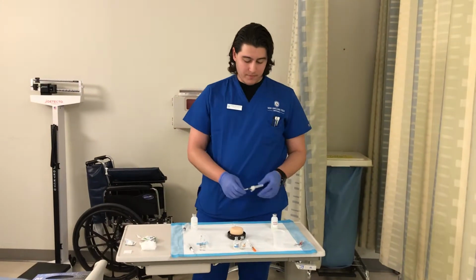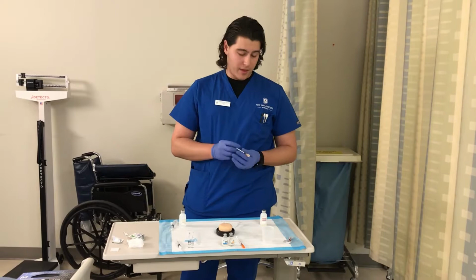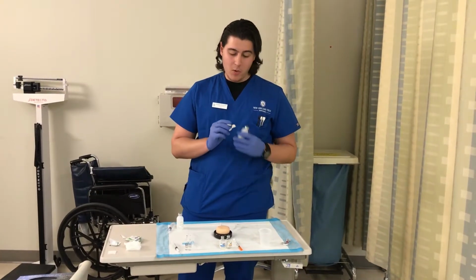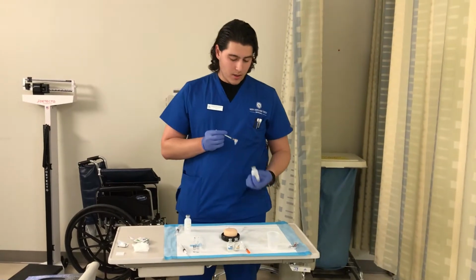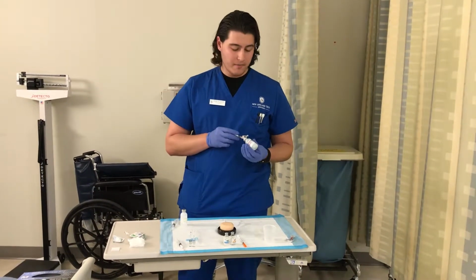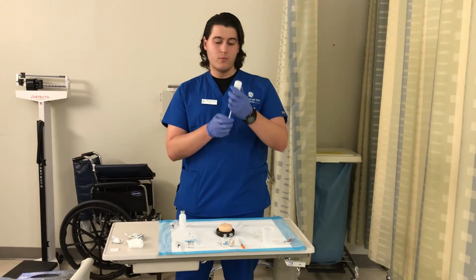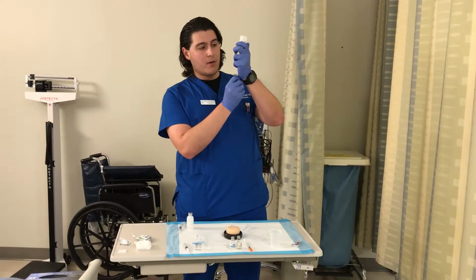So for our intradermal, this is going to be just under the skin. With any injection also, you want to know what you need to inject first. So I'll say 0.1 ml. You would insert into your medication, make sure I have the right medication, it's not expired. When you withdraw it, you aspirate it. It's always upside down, and you pull out the correct amount that you need.